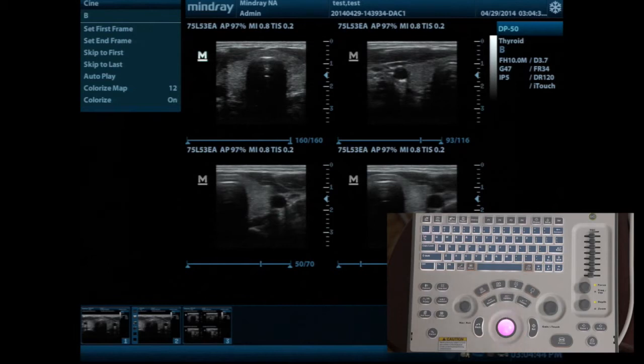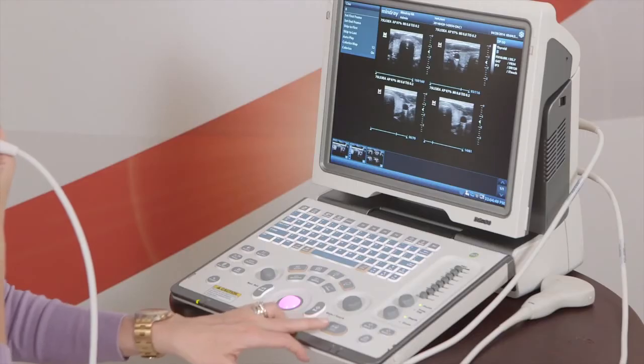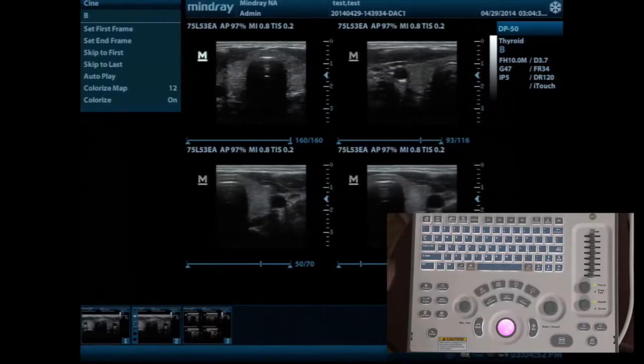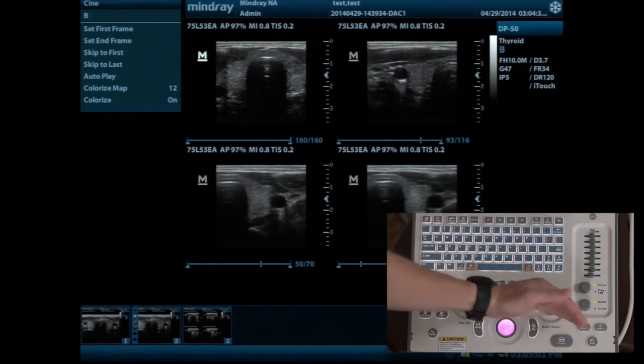When you hit freeze, you'll see that right now it's backlit orange. That means it's active and functioning. You also have a little snowflake up in the top corner, which I always like to point out. It's a little symbol. It shows that you're frozen. But the best way to always know things are active and functioning is the orange backlight on the machine.